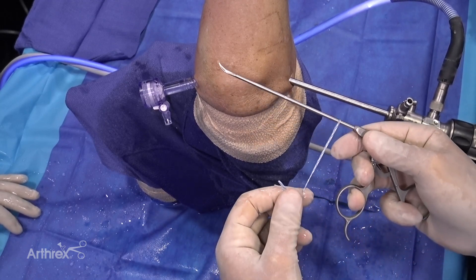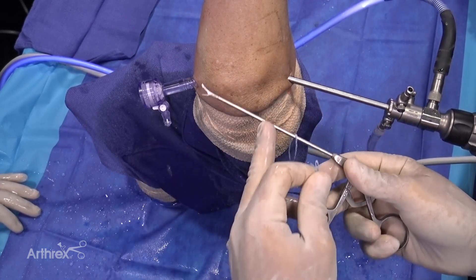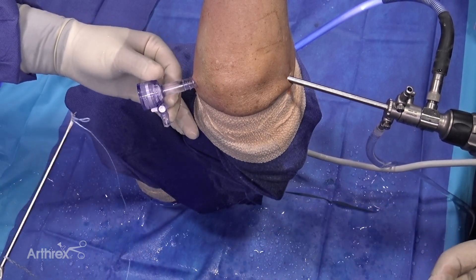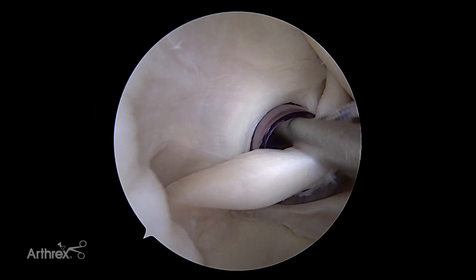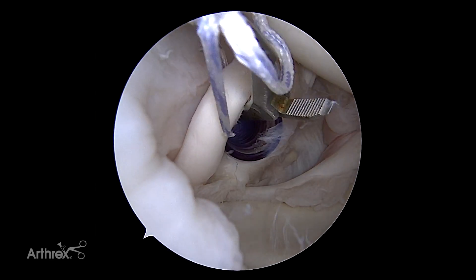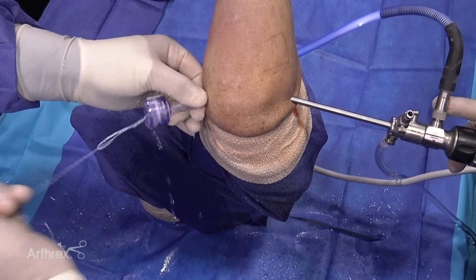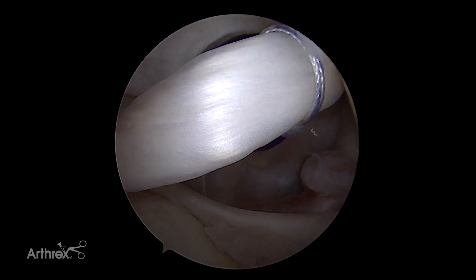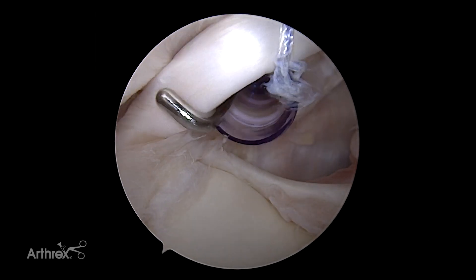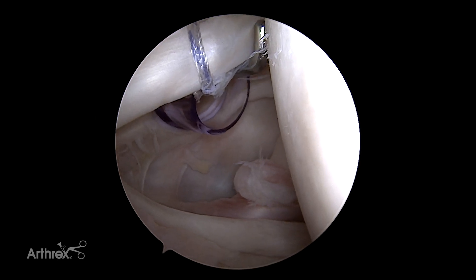We are going to go ahead and create a loop intact knot using this grasping bird beak. The great aspect of this bird beak is it has teeth at the end that will allow you to easily grasp the suture. I have put the loop over the shaft of the bird beak and now I'm going to grab the tail end using the tooth portion. We are now going to reintroduce the suture over the top of the biceps and come underneath and grab any part of the suture that is exposed to create our luggage tag. This is actually the key portion of the case, as the tension on the biceps is determined at this point. If you are trying to put less tension on the biceps, you are going to put this loop closer to the insertion at the top of the superior labrum.